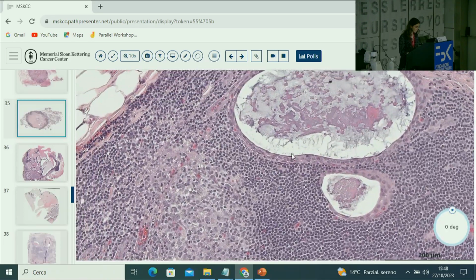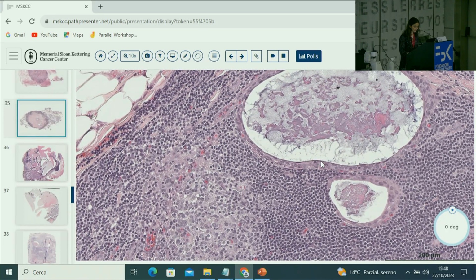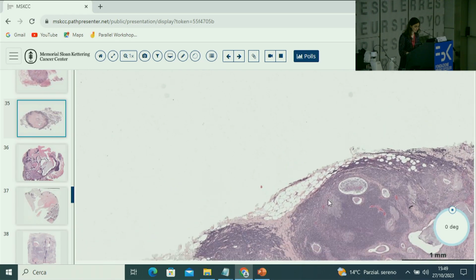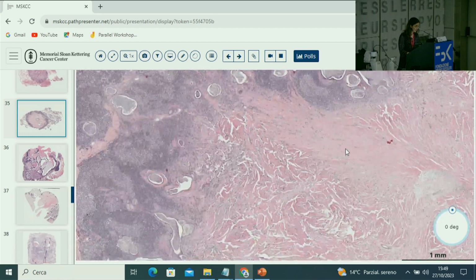So we don't always see mucocytes, but these are glandular and basal squamous cells. If you do stains here, you see that these are biphasic, although they look very denuded. They can have these atrophic changes, and it's very common to see lymphoid stroma. So it doesn't look like typical mucoep, but it is a mucoepidermoid carcinoma.